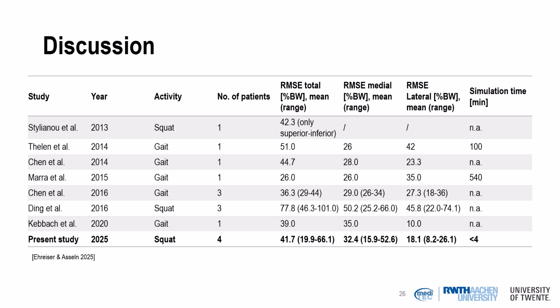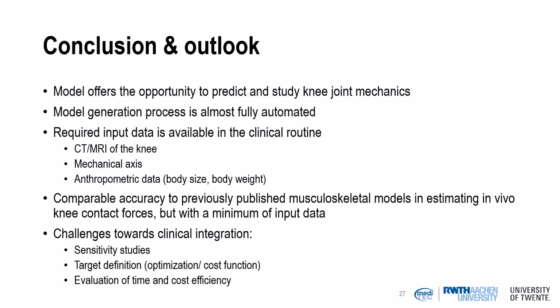we selected, we remeshed our implant components and identified a certain density, which gave us a good trade-off between computation cost, but then still a good contact behavior. So coming to the conclusion and outlook of this presentation.